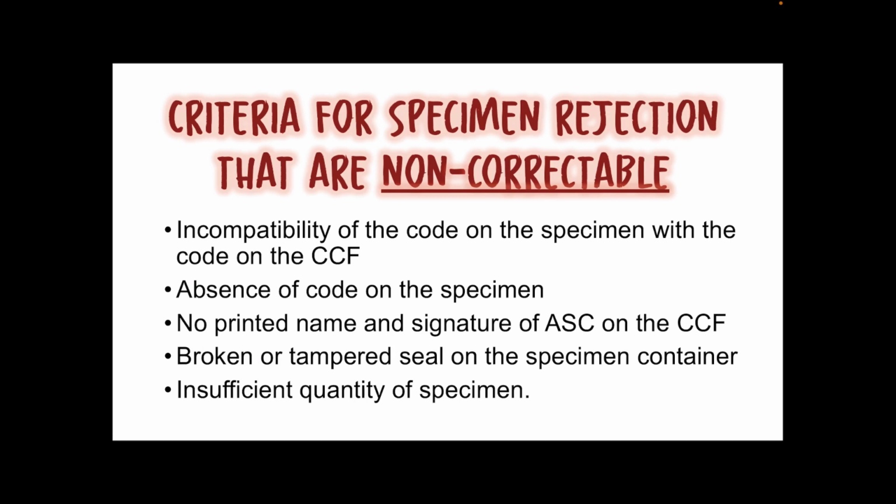And also the absence of code on the specimen, no printed name and signature of ASC on the CCF, broken or tampered seal on the specimen container, and insufficient quantity of the specimen. Again, it's 60 ml for single collection and 2 30 ml bottles for split collections.